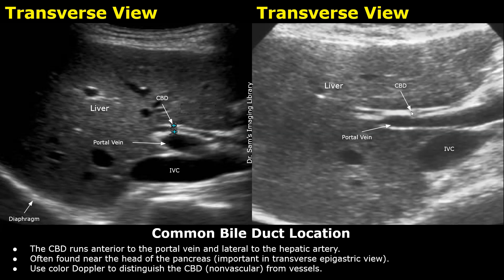This is the porta hepatis. The ultrasound probe is in a transverse orientation, focusing on the porta hepatis. When you see the main portal vein here, you will often see a thin tubular anechoic structure with hyperechoic walls, anterior to it. This is the common bile duct.